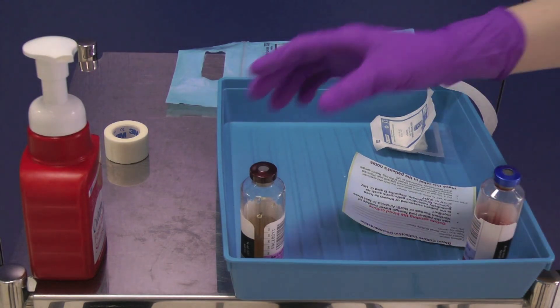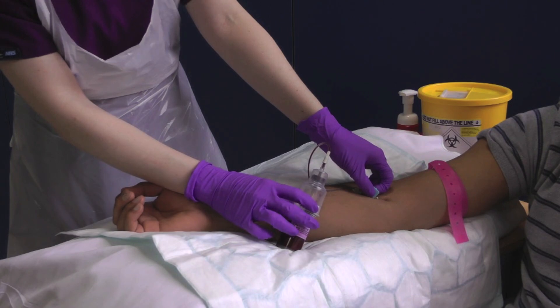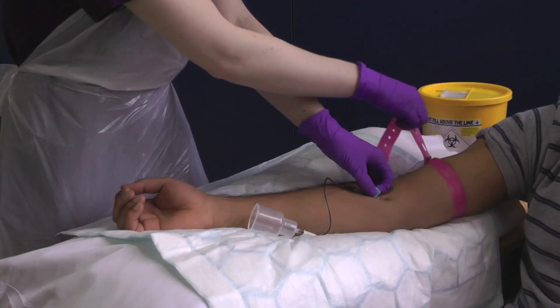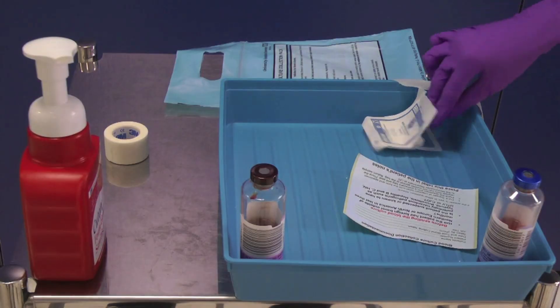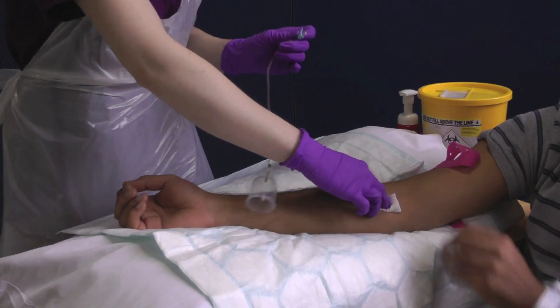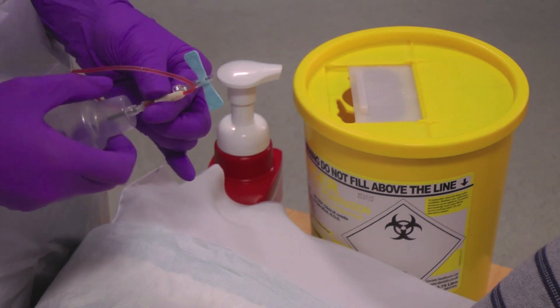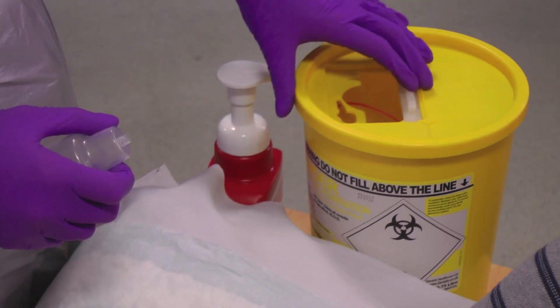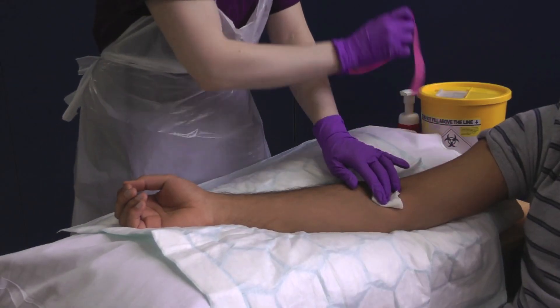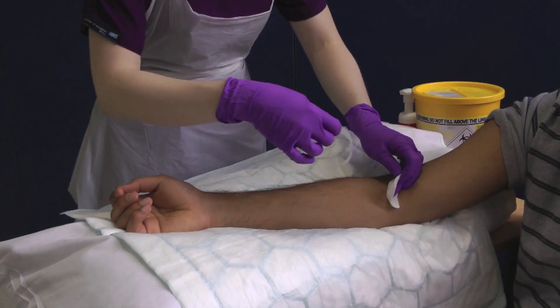Remove the aerobic bottle and repeat the procedure with the anaerobic bottle. Remove the anaerobic bottle and release the tourniquet. Without pressure, apply the sterile gauze to the puncture site. Withdraw the needle and pull the wings up to resheathe it. Unscrew the adapter cap and put the needle immediately into the sharps bin. You can now apply pressure directly over the puncture site. Use a piece of tape to secure the dressing.